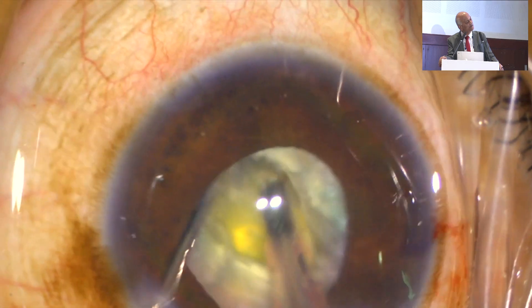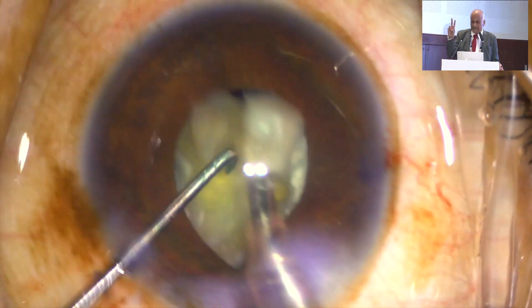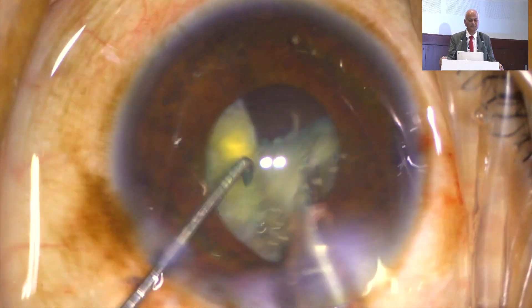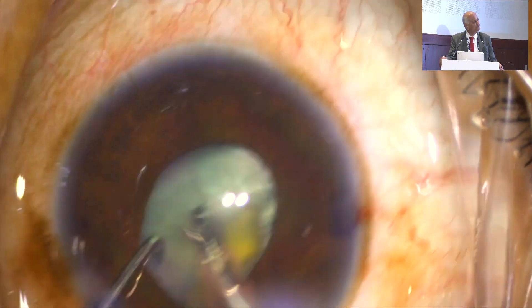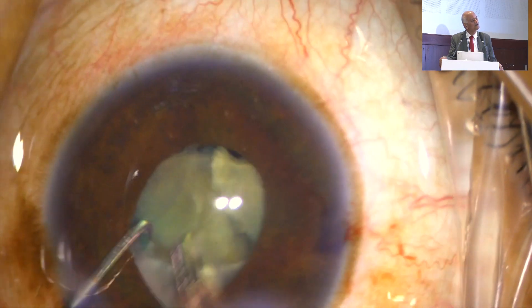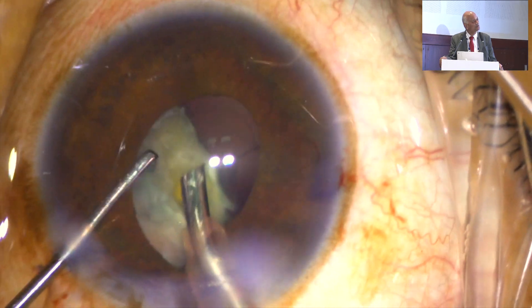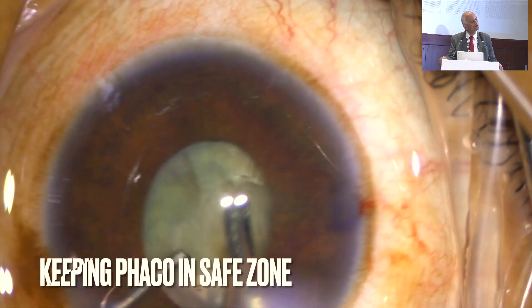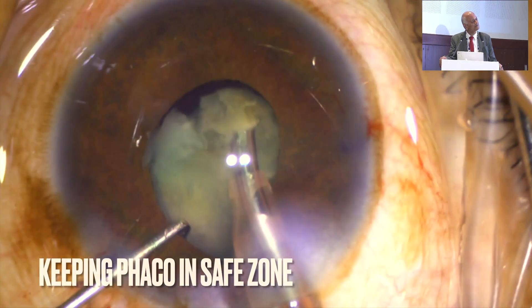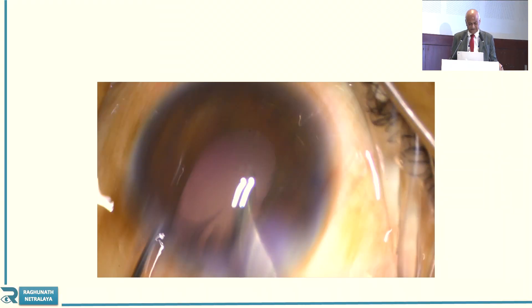Whenever you are doing faco-emulsification, the separation of the piece up to the center is very important. This patient is having neck movements and I am operating in that situation. You can see the patient is moving, and here you can see I am taking care of the iris and have completed the faco-emulsification.